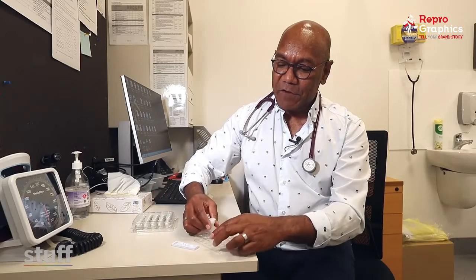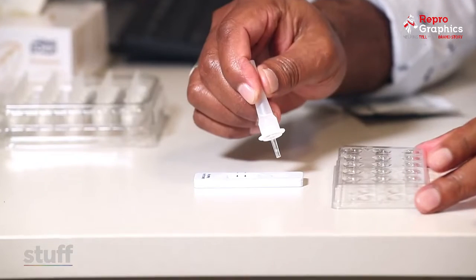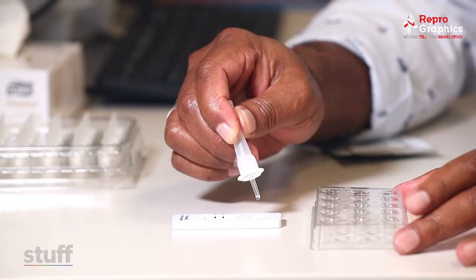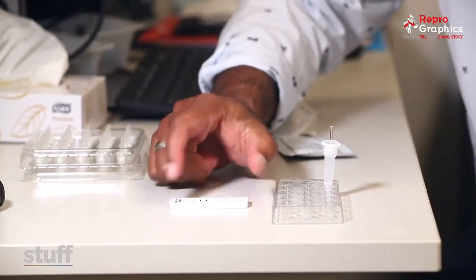So now it's ready, and you put it into the well — four drops into the well. One, two, three, four. And then you wait 15 minutes to see the result.